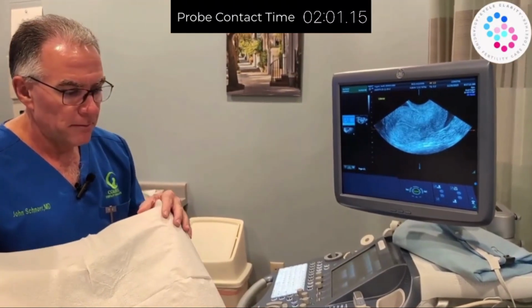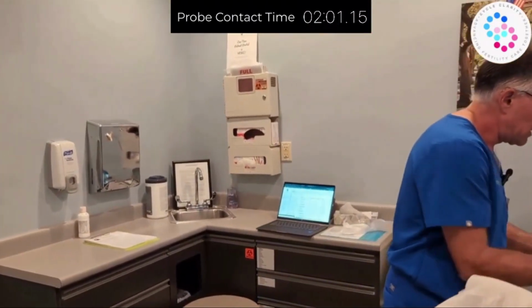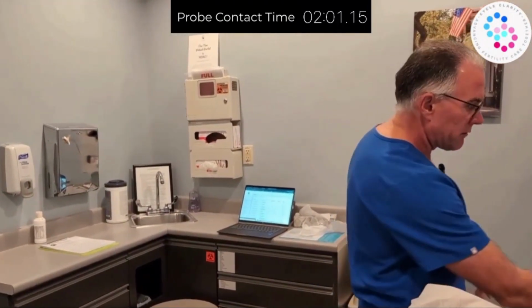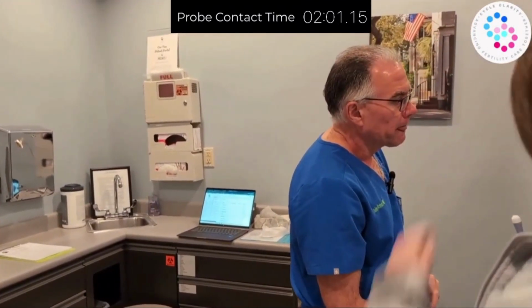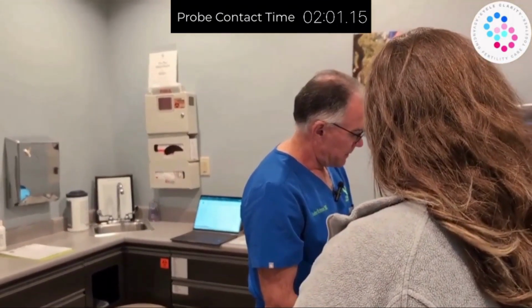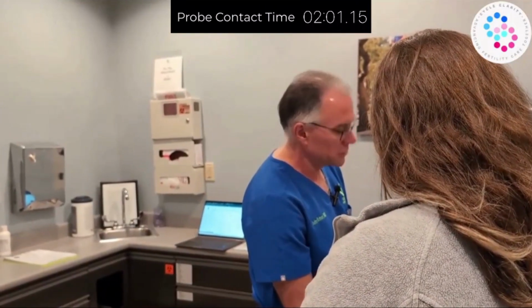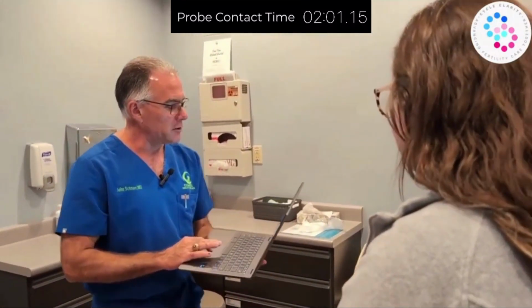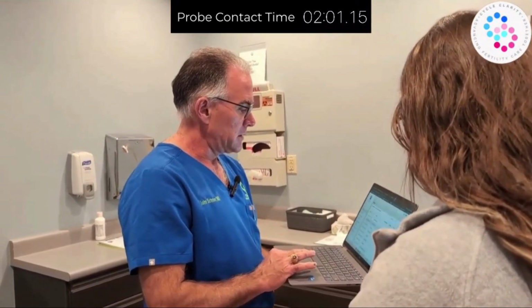I'm going to help you up. You did just great. All right, let me show you some of your results. So we're going to save this and first go ahead and send this off. Okay, and then let me show you on the laptop where those eggs are, and we'll make a plan for what's next for you. So we're going to log into the application which has your image analysis in it.